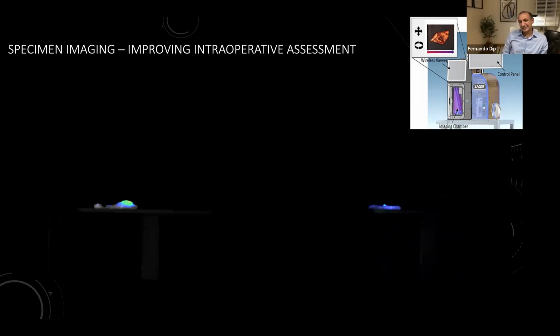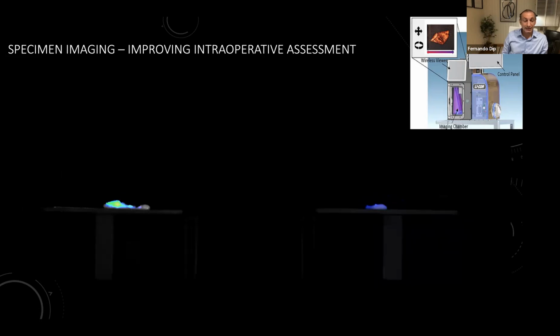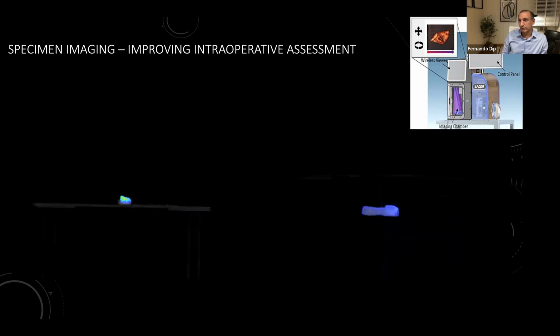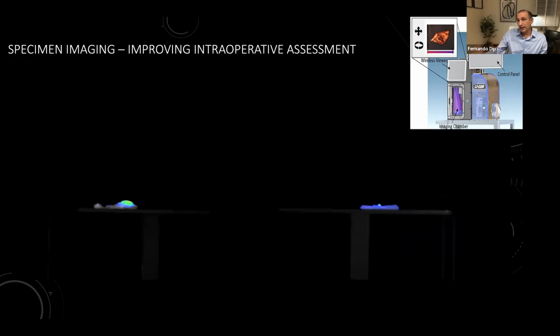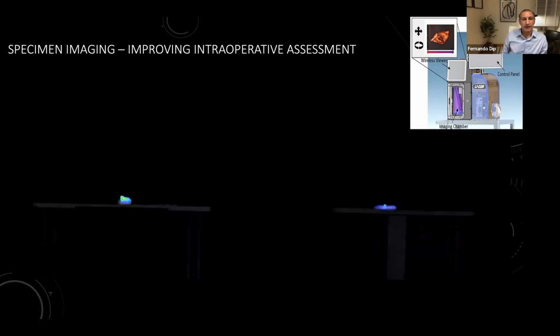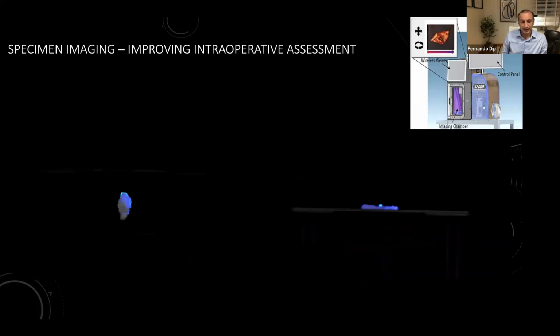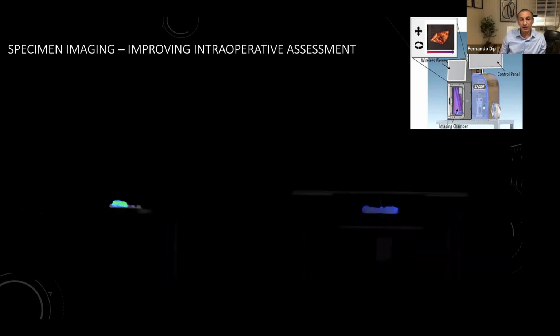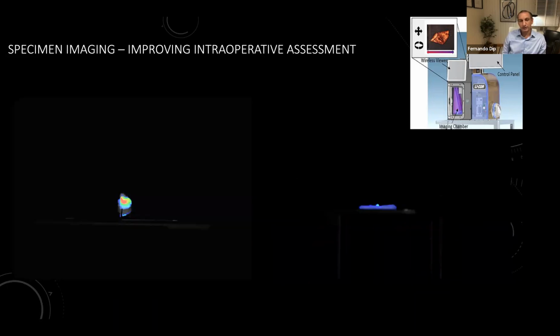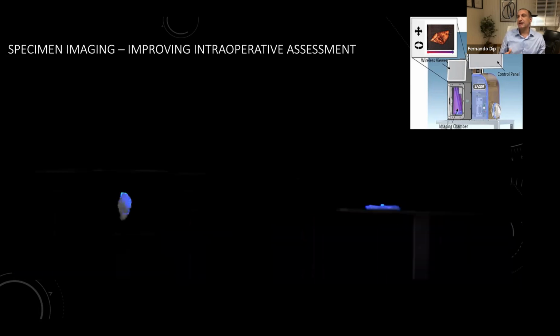Jason, I believe this is really very important because I personally do surgical oncology, and one of the reasons we still have recurrences in the tumor is because sometimes we leave a tumor behind when we are operating, and sometimes we have a frozen section that is negative, and at the end, it probably is not. And I believe this is going to give us much more information. So my question is, where are we now with this technology?